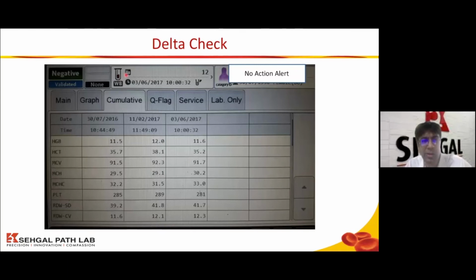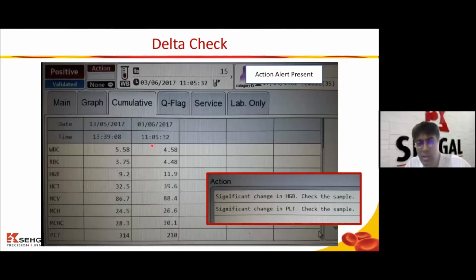Now, for example, here there was no action alert. If you see, the hemoglobin is pretty stable, so based on the criteria you have entered into the machine, it did not give an action alert after doing a delta check. However, in this example, you see this is the action alert marked over here.